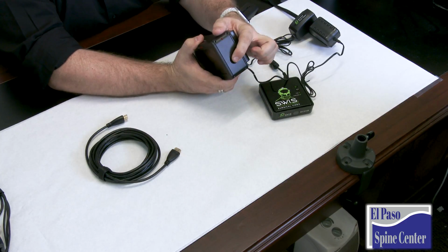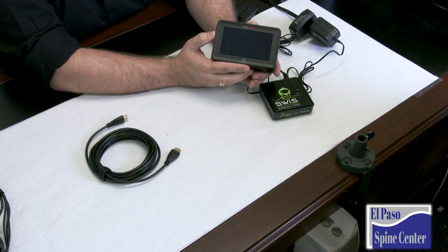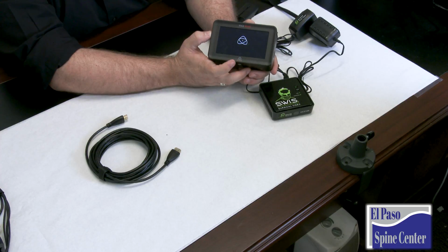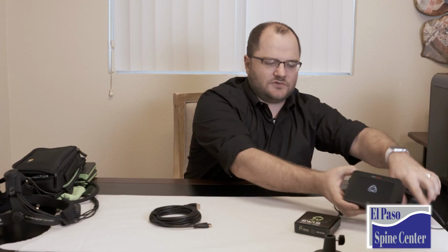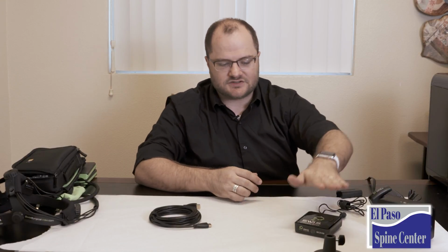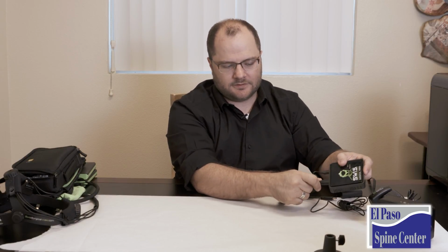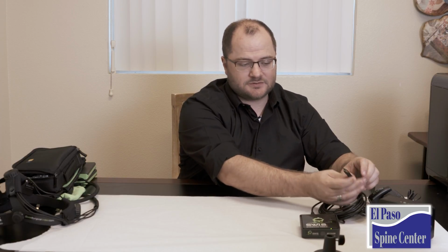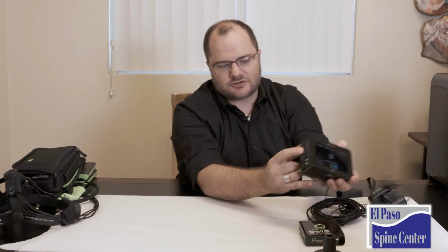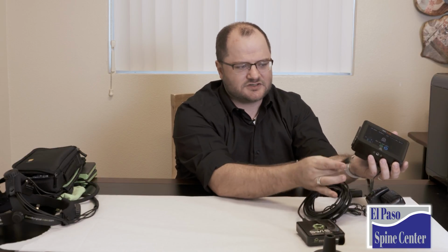The power button is on the right-hand side of the unit. You press it once, and in just a minute, you'll see the Atomos signal, and it'll start to turn on. Now, to connect our wireless system to our wireless receiver, we have our HDMI. It's very simple. Plug the HDMI in here, and I'm going to keep this cable coiled for the moment just for space purposes. HDMI, make sure you put it into the in slot. It's very easy to get those mixed up. I've actually mixed those up before and then wondered why my system wasn't working.